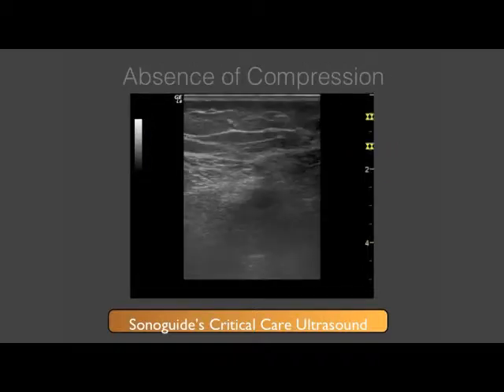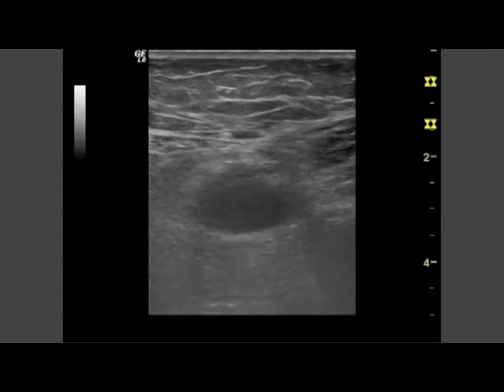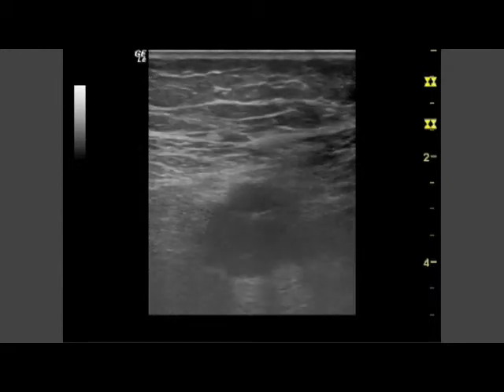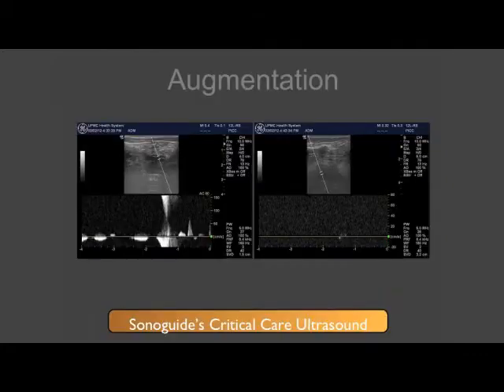Utilizing some of the skills covered in earlier chapters, you will recall that veins with a DVT will not compress as easily with external pressure from the ultrasound probe. Note that here in this video. Notice that the artery, identified by the strong pulsatile flow, is starting to compress without any change in the caliber of the vein with the DVT.